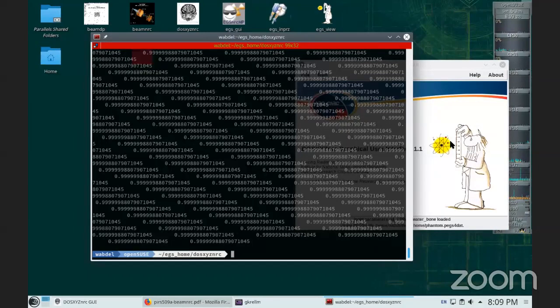People are asking a private question: how can we get the MMCTP software? Just type MMCTP, and you can get it for free. It's open source, on GitHub. But I think I ran it on a Mac.